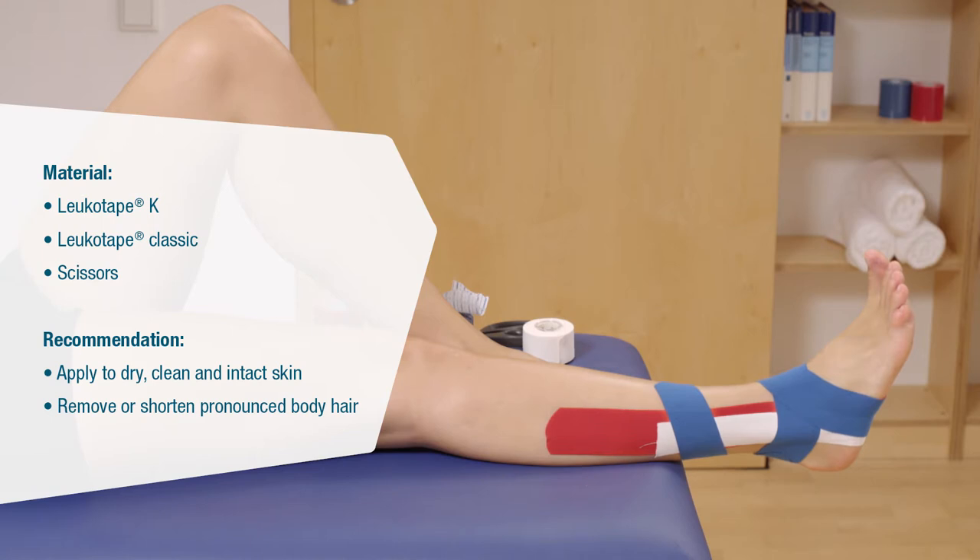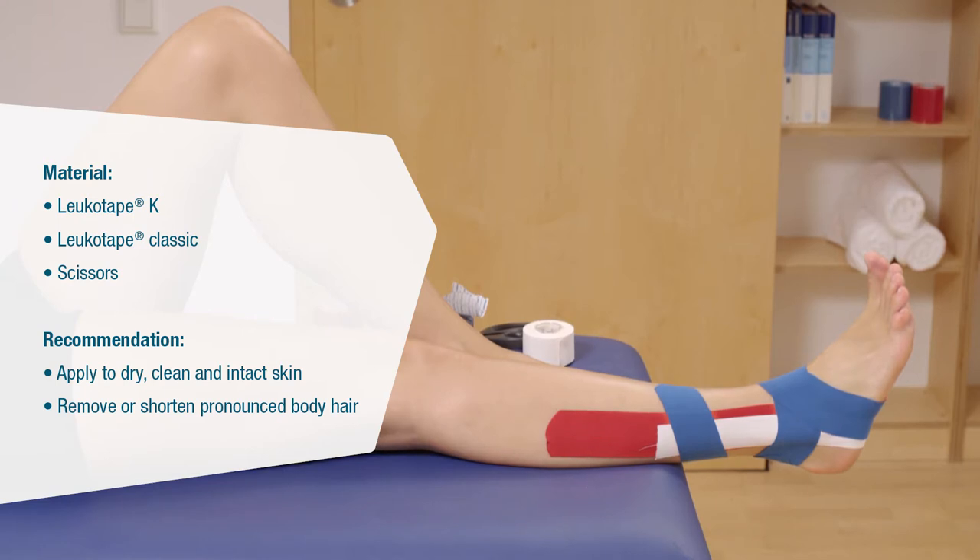Apply the tape to dry, clean, intact skin and remove any excess body hair for better adhesion. The patient must hold the ankle at 90 degrees for application.